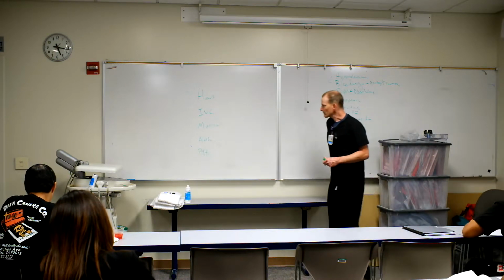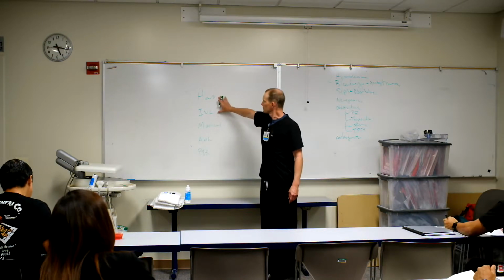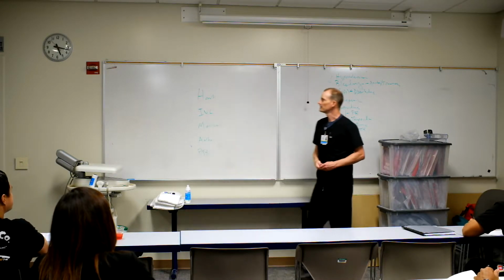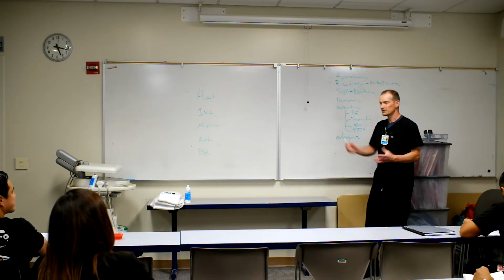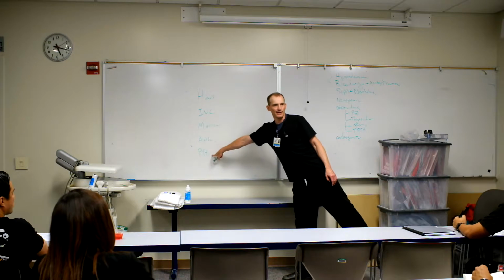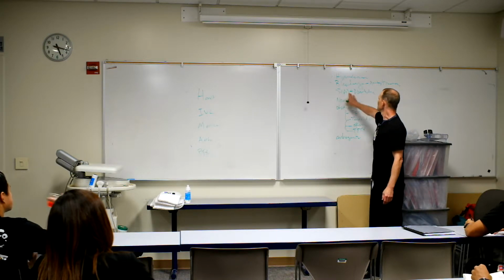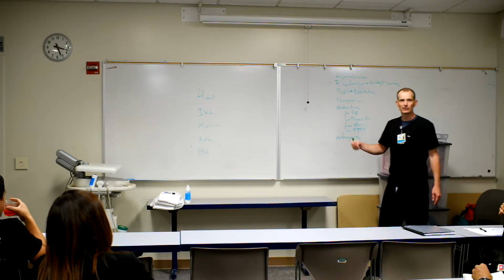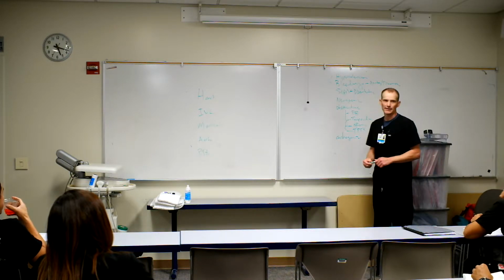Okay. So the heart is going to be the most complicated of all this, and you're going to look at it with what's going on with the IVC too, of course, right? You guys already know enough about what you're looking for with the heart, but first of all, how is the left heart beating? If it's doing this, then there's a good chance you're doing this, especially if you've got B lines all over here. If it's doing this, you could be here, here, or here. You're going to see the RV looking funny, but we'll get to that. But you can tell if the heart is getting filled or not, and whether it's dealing with that filling well.